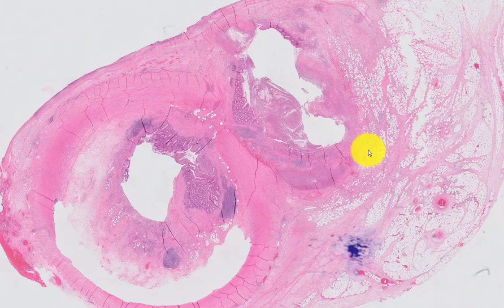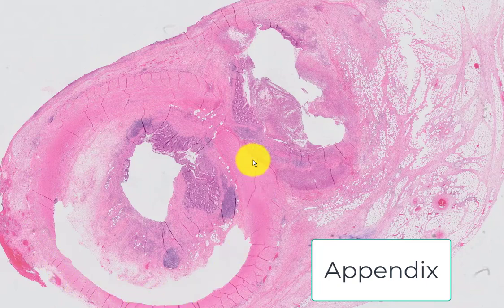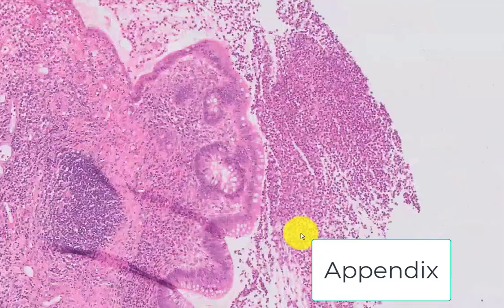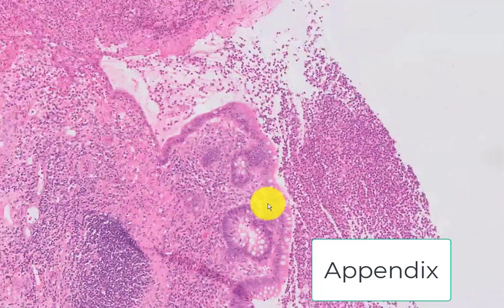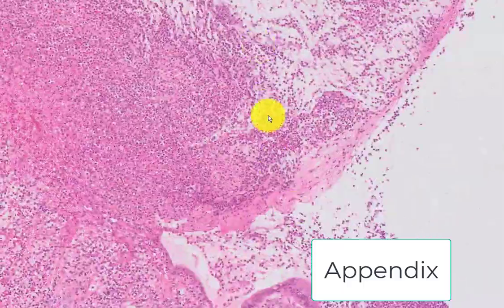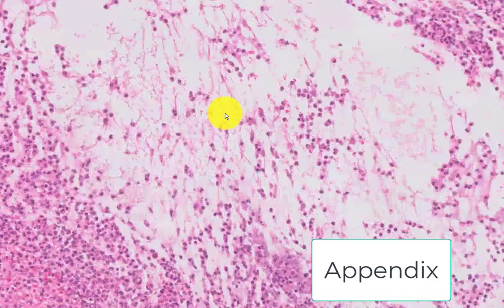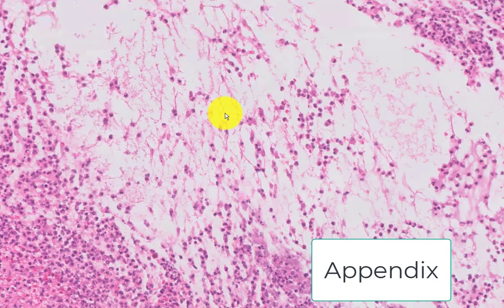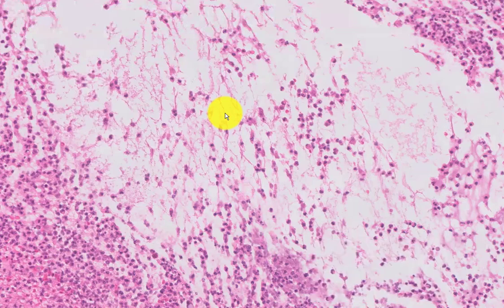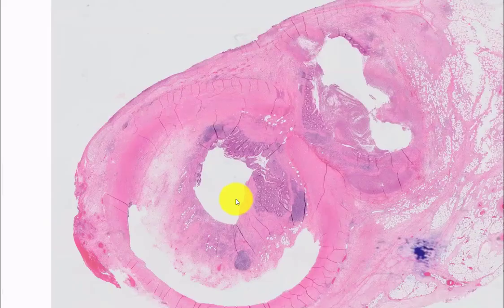This is a section from the appendix. Here's the appendix right here, but what I'm going to prove to you is that this mucin right here is not a low-grade mucinous neoplasm. Let's start with the appendix itself.